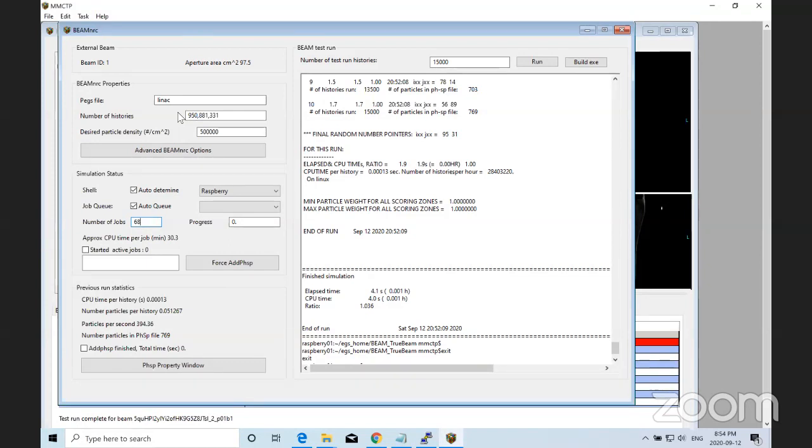That's why the more cores you have, the better. But if, for example, you cannot afford it time-wise, once you have done the calculation and at least the script runs with no errors, then you can manually change either the density you want, or you can just put in, look, I want 1 million. I will be happy with 1 million. But then the particle density, because probably you're going to use this for a dose calculation, might not provide you with very good particle density.